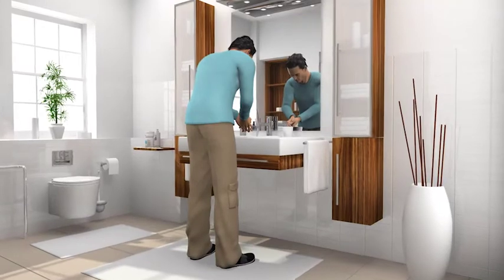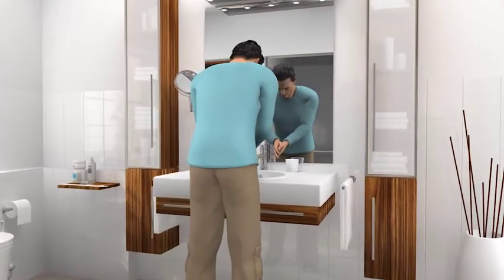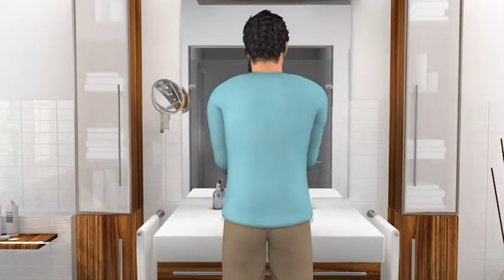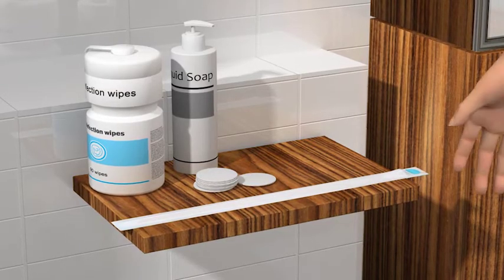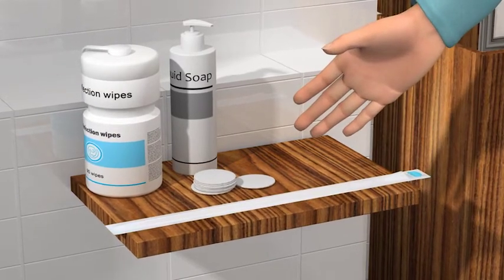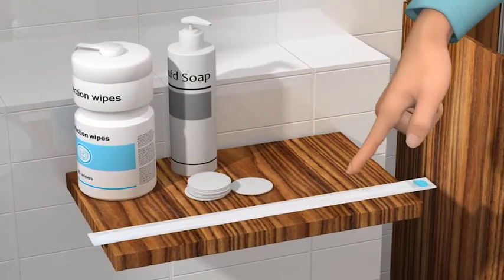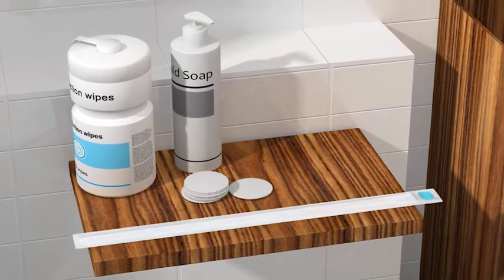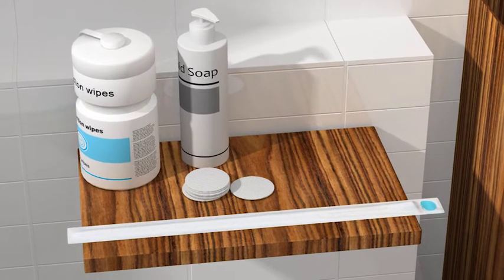Start by washing your hands thoroughly with water and soap. Remember also to wash your thumbs. Alcohol hand gel can be used if you don't have access to washing facilities. Make sure to have all the equipment you will need ready before you start the catheterization. You will need a catheter of the appropriate size and perhaps a urine bag. You will also need intimate wipes or soap with neutral pH value and water to clean your penis.